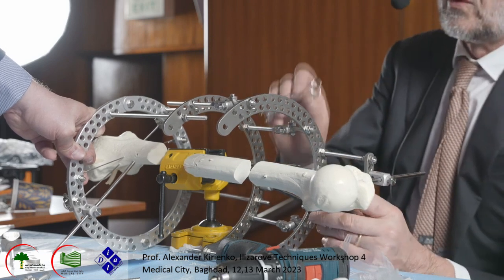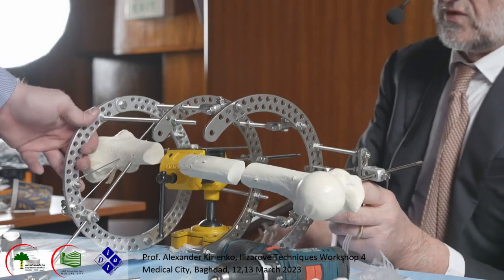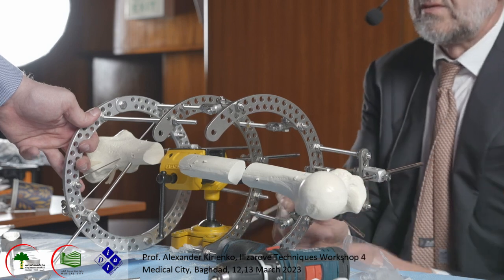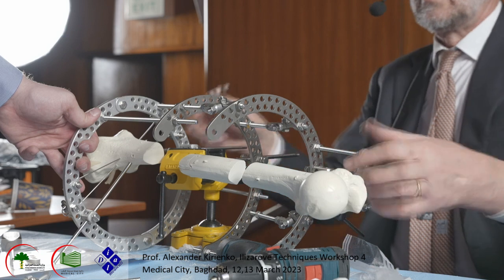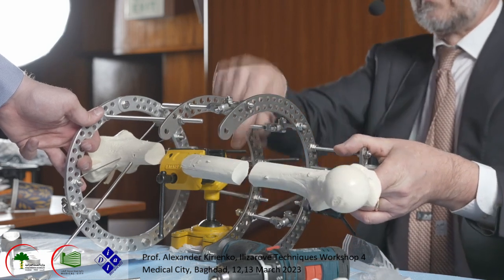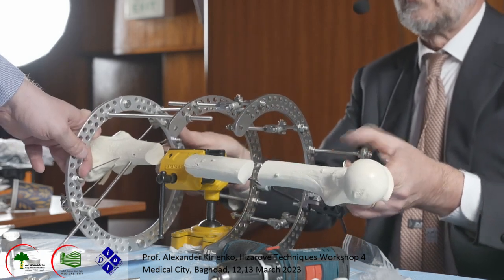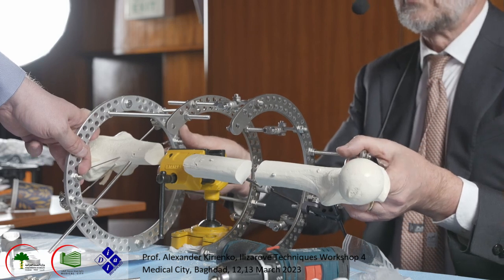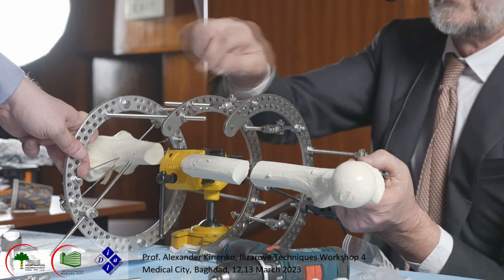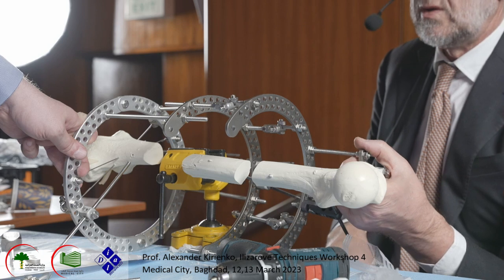What you do is only compression of the two external rods, this way. And this helps us to correct varus deformity, like this, you see? We do compression of the external rod, and we correct varus in this way. But only after you achieve the lengthening, because if you do it before, you go into shortening, you don't have any correction.